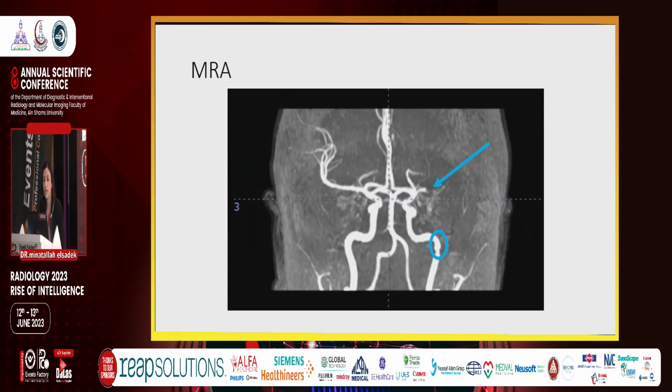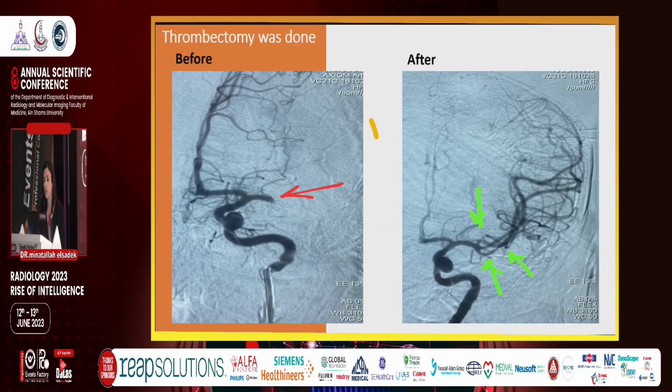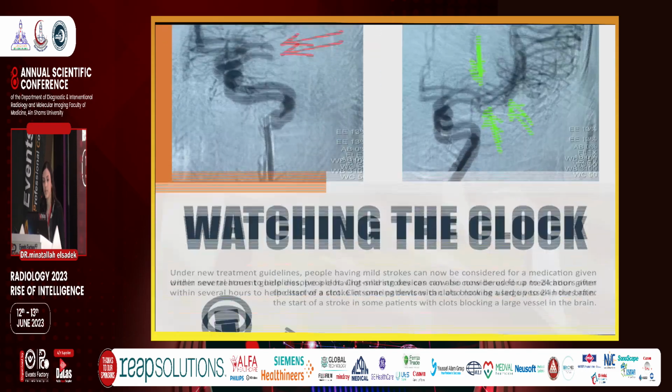Okay. It reveals occluded left MCA with proximal intraluminal thrombus, as well as mild to moderate focal stenosis in the ICA between the cervical and petrous segments. So finally, we reached a solid diagnosis. This boy suffered hyperacute stroke, left MCA occlusion. Accordingly, mechanical thrombectomy using a stent retriever device was urgently done. Here are the before and after angiography images showing complete recanalization of the left MCA.